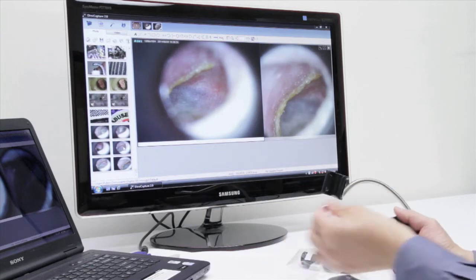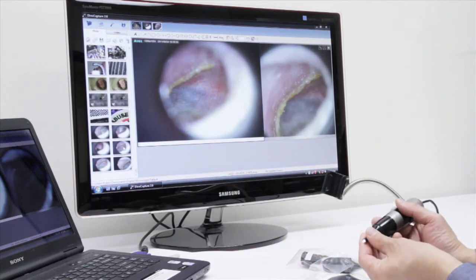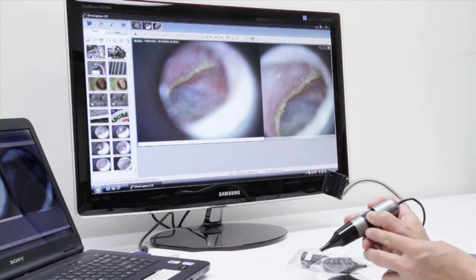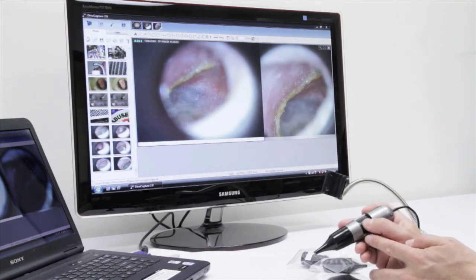This scope also comes with three different diameters of disposable ear specula, ranging from 3, 4, and 5mm diameters. Applying the specula and putting it into the ear is very simple.